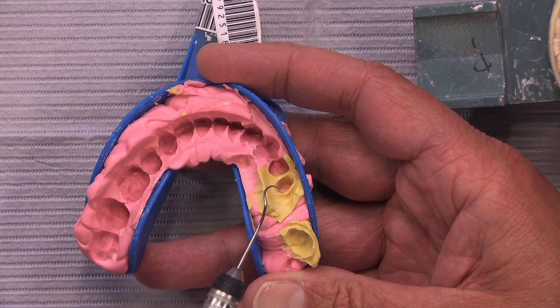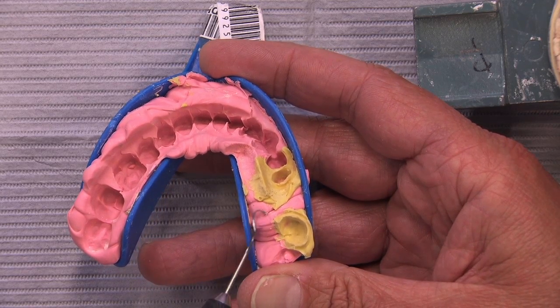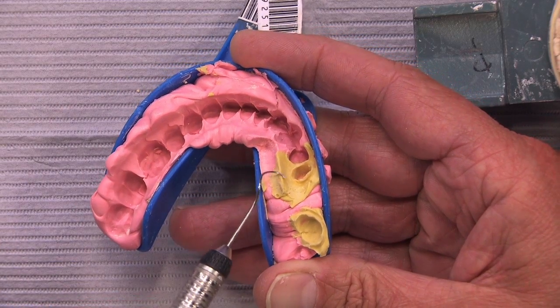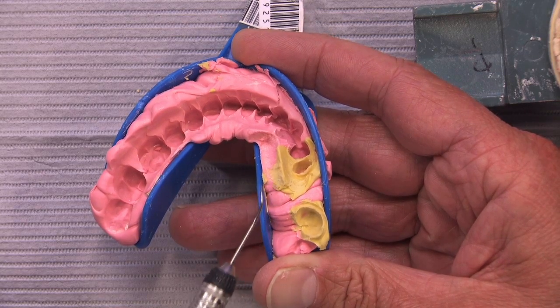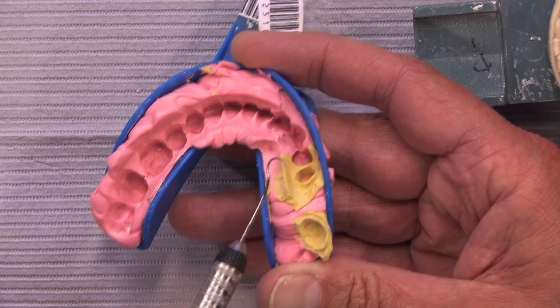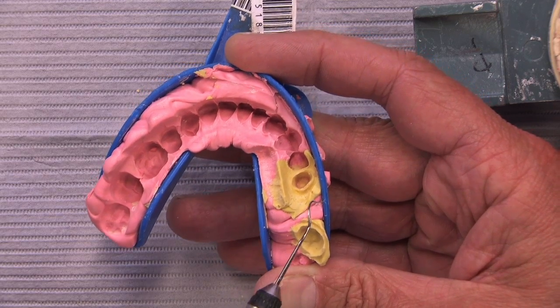But even if you just squirted it here and here, even if you really didn't get any yellow here, but they set up together, you can just tell this wasn't in contact with the tissue because of these folds that you see here. So even if you had just done this little bit of yellow and then seated this tray all the way down against that ridge, these two materials would be indistinguishable from each other except for the color. And so when you see those together where it looks like it's all pink and then it just happens to be yellow here and it's all one impression, instead of what we have here where it looks like a dry lake bed with some more impression material on top of it, you can still get a successful restoration. So because of a lot of these factors, that's why we're going to need to ask for a new impression.